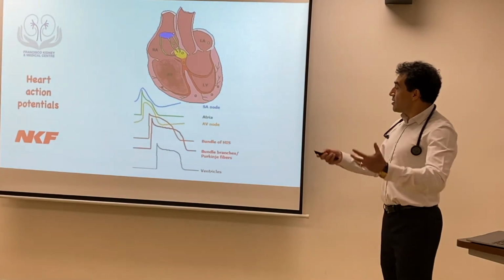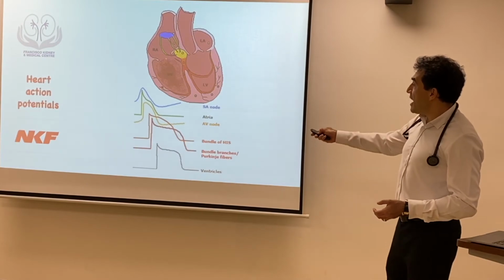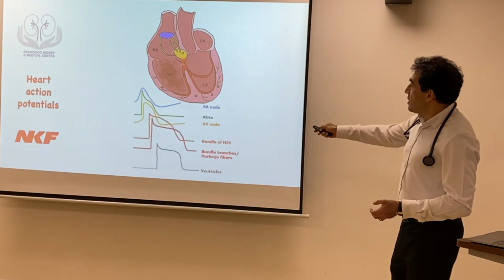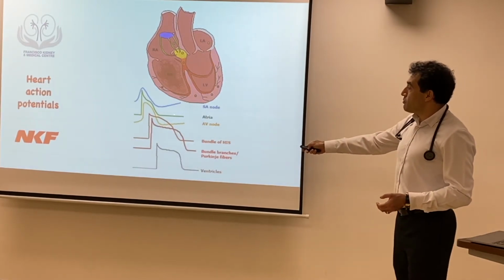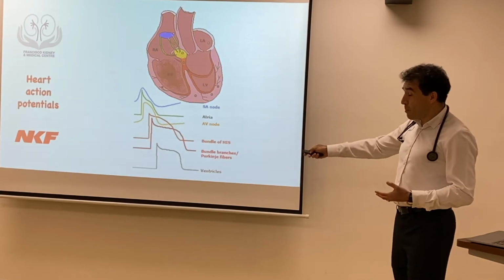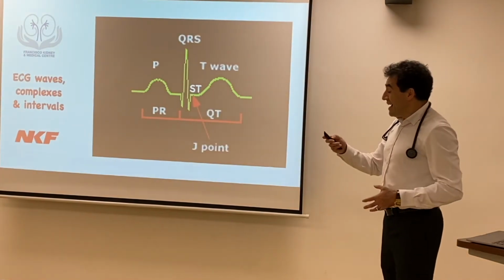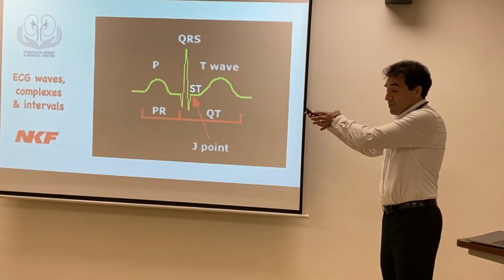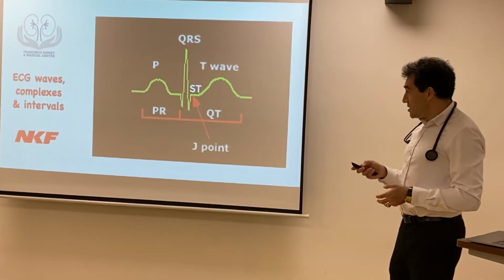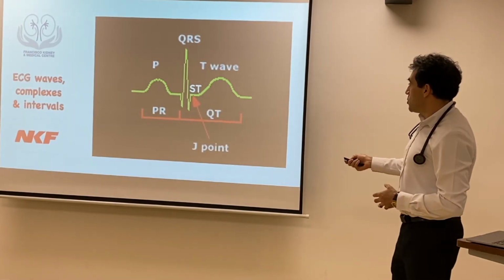When the heart starts contracting and activating, we see a lot of electrical activity. Every region of the heart, you're familiar with these regions, produces a curve of its electrical impulse separately, yeah? But overall, all that together gives the waves, complexes, and intervals that you normally see in the ECG. This is the summation of all those curves that I just showed you.